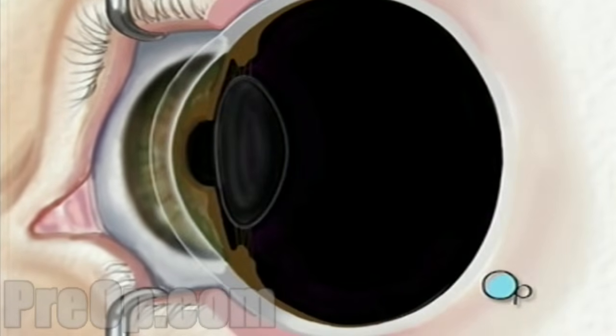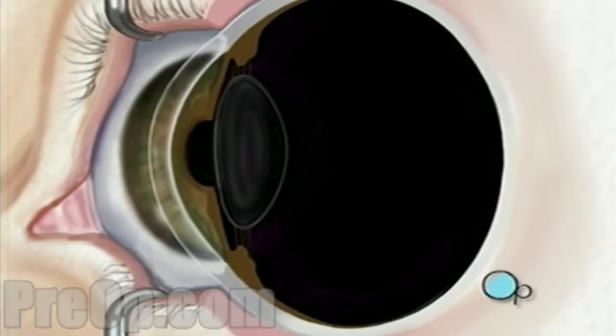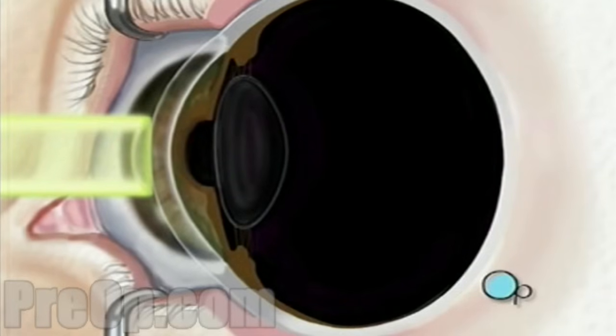Next, your doctor will use a computer to control pulses of cool laser light. These pulses will delicately remove microscopically thin layers of cells from the stroma.